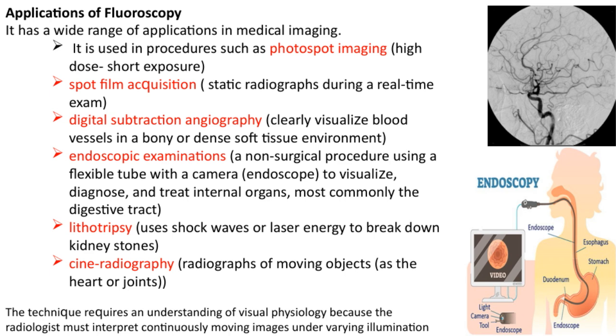Now, it's essential to understand that working with fluoroscopy requires a good grasp of visual physiology. The radiologist needs to interpret continuously moving images, often under changing lighting conditions, which makes it quite a skillful task. All these applications highlight how versatile and vital fluoroscopy is in modern medical imaging, contributing significantly to diagnosis and treatment.